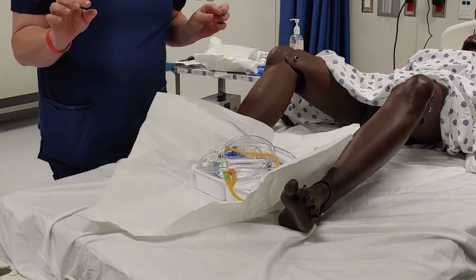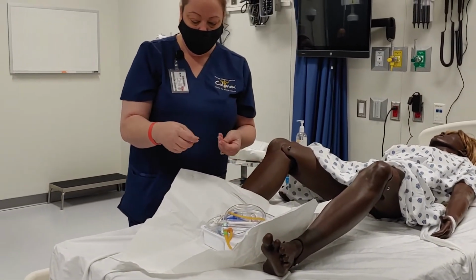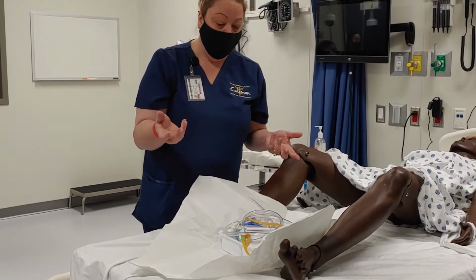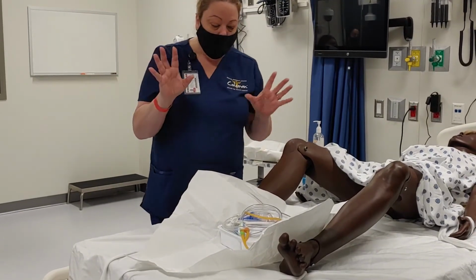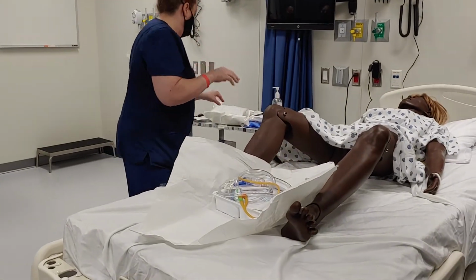Okay, first thing I'm going to do: do you think that this catheter needs to stay sterile? No, because it's going into the... Yeah, I mean it does, especially the part that's going to be inserted inside the urethra. So at this point, I'm going to go ahead and put my regular gloves on.